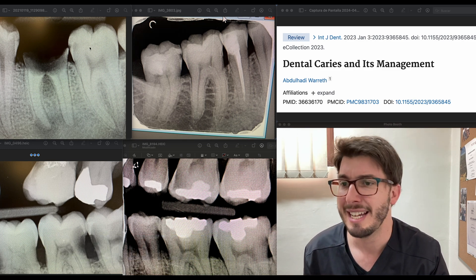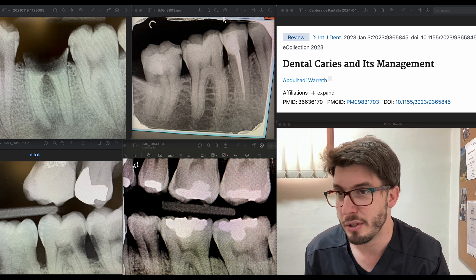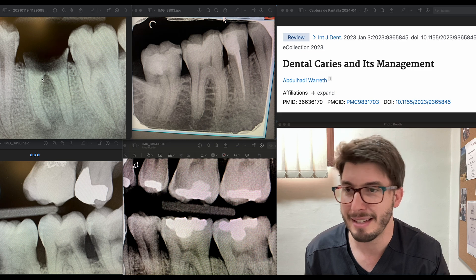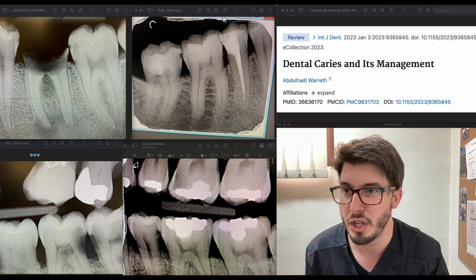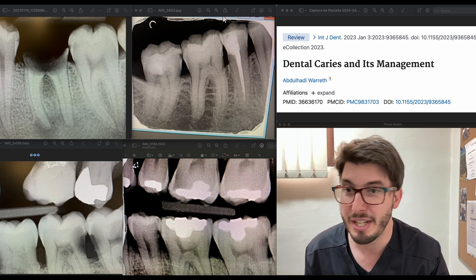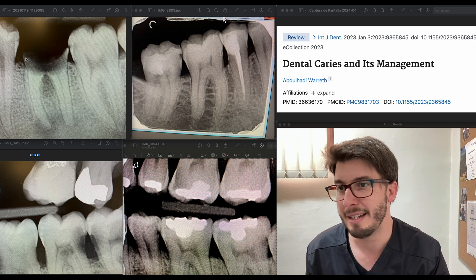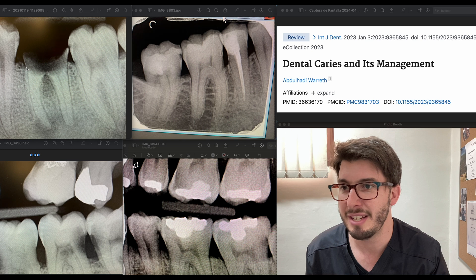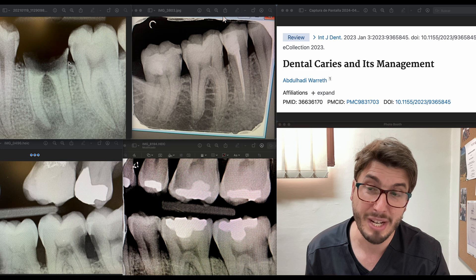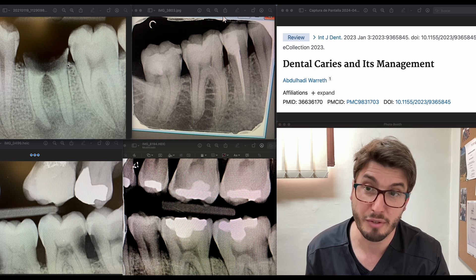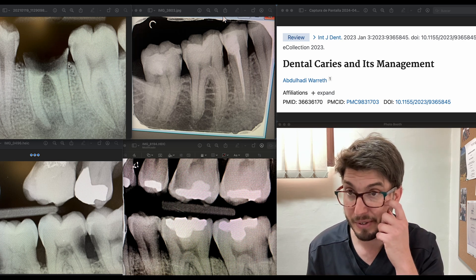Starting with the top left corner of the screen — this case is no longer caries only. We have destruction of the crown, and take a look at the very little tooth tissue remaining. What is the predictability of this area? There is tooth destruction even close to the alveolar crest, so the odds that you can rehabilitate this tooth without it fracturing are very low. In this case, extraction would be the first option.